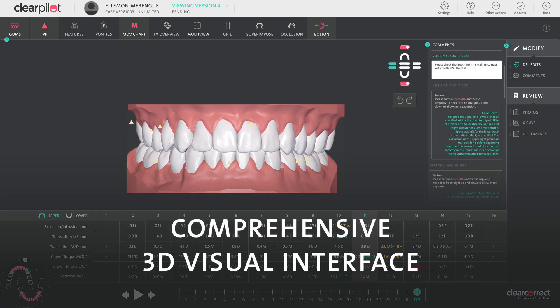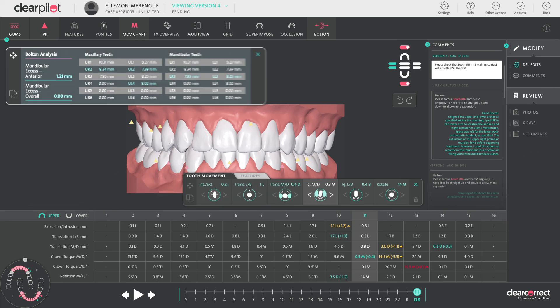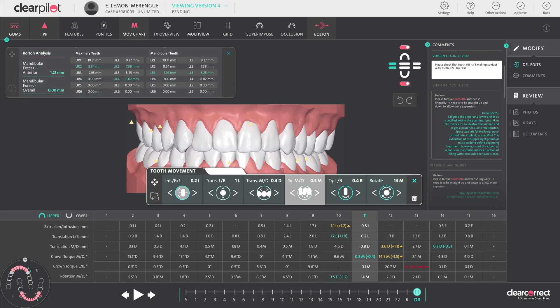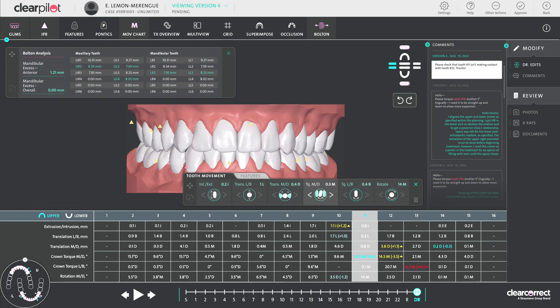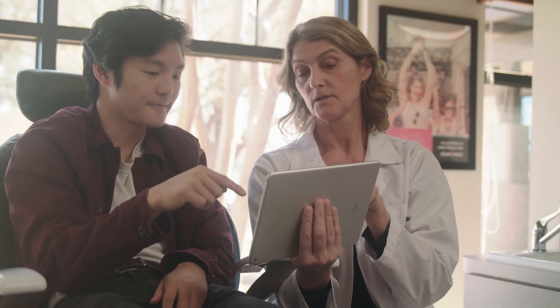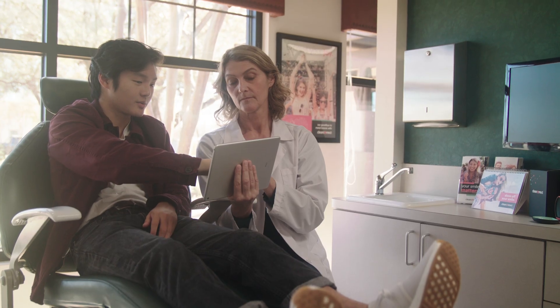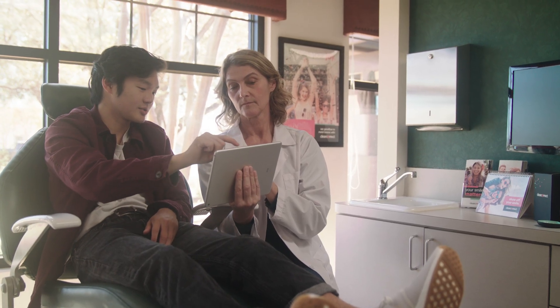ClearPilot's comprehensive 3D visual interface is packed with ways to view and customize your patient's case, empowering you to personalize treatment strategies, perform meaningful clinical evaluations, and increase patient engagement.